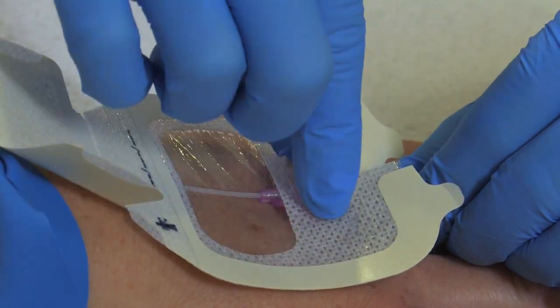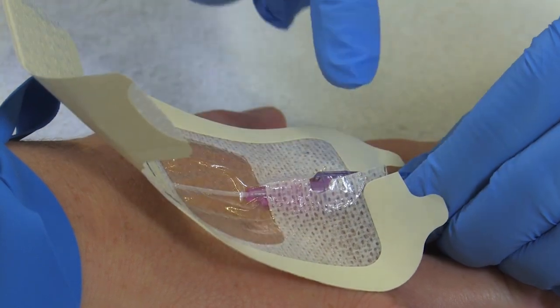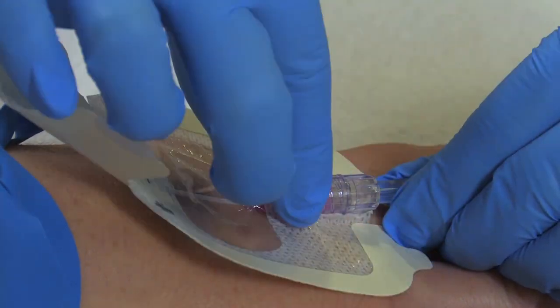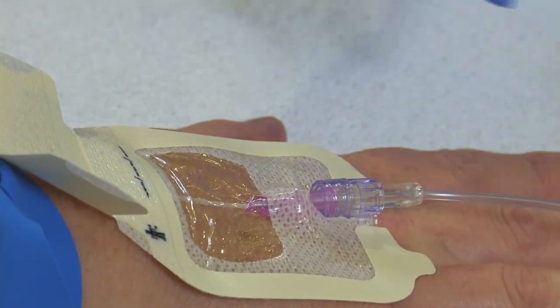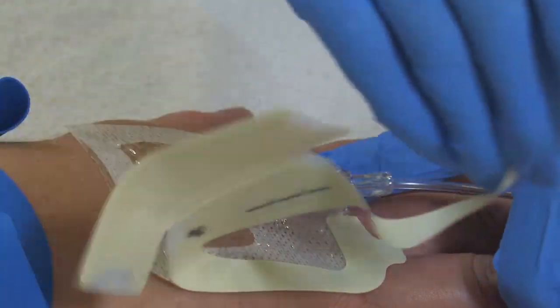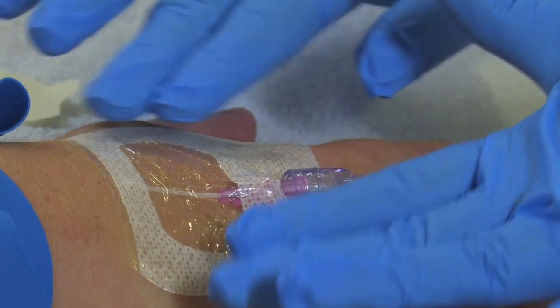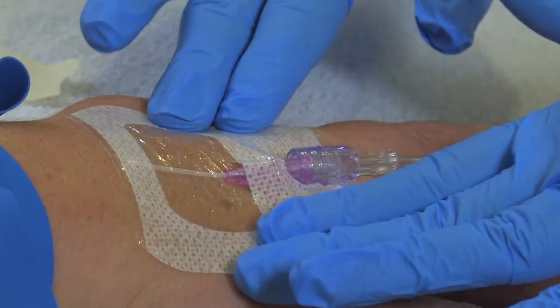And the important part is to pinch right here over the colored catheter so that we can carefully push the wings underneath the luer lock device and create a secure placement. Okay. Then we're going to remove the frame. And we really want to push down and adhere the 3M to the surface of the skin, because remember, the skin isn't smooth, it's full of valleys and hills, so we want to make sure that it is really adhered to the patient's skin.